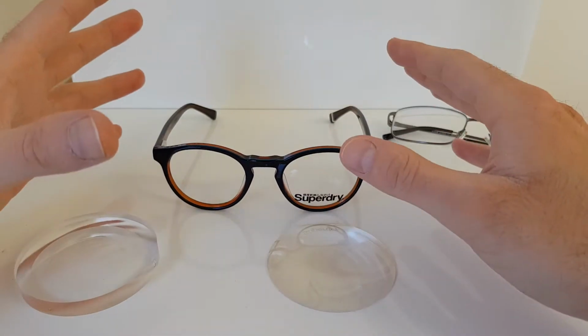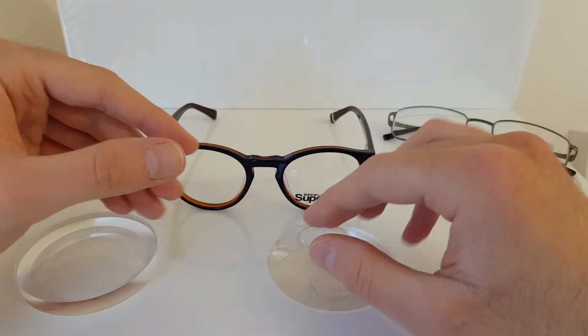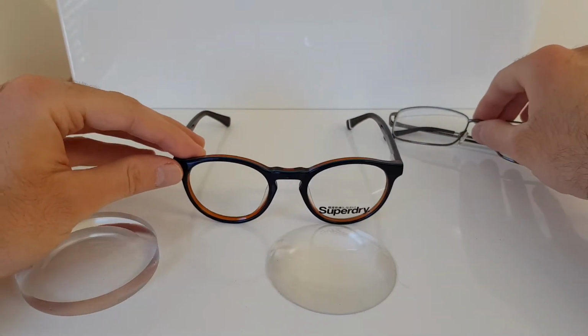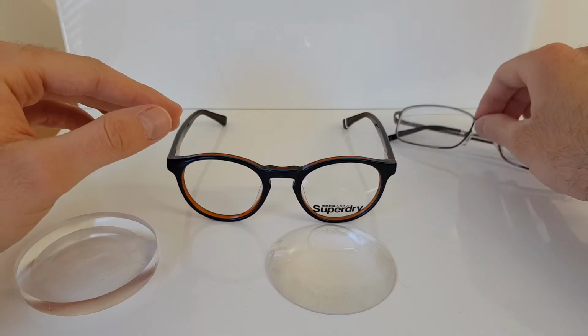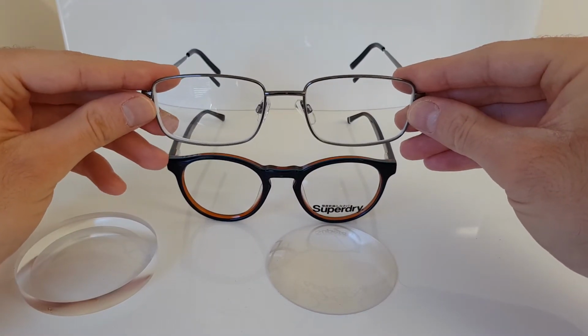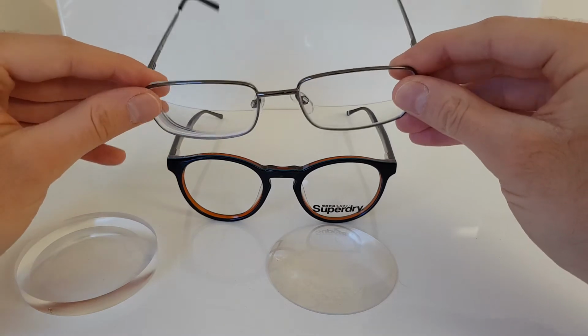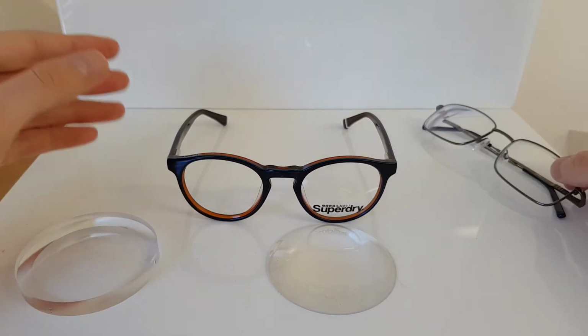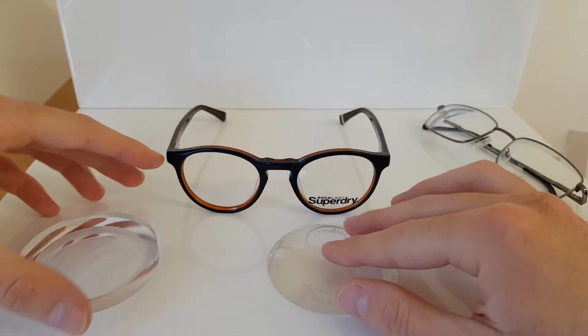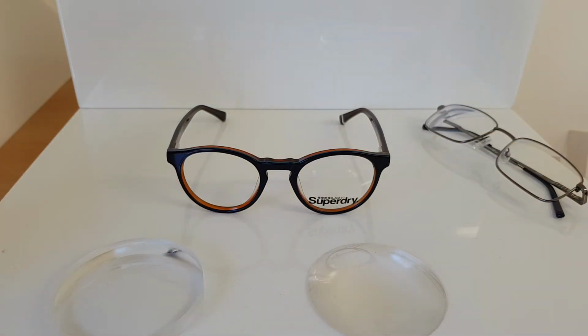So don't go for an oversized frame, because what's going to happen is you have a lot of excess lens, which is then going to result in the frames becoming a bit thicker and heavier. So if you had quite a petite measurement, a frame like this, for example, which is quite a bit wider, is going to end up being a lot thicker. Okay. Going for a narrower frame with a smaller eye size, a smaller lens shape, is going to help reduce the thickness of the lenses as well.